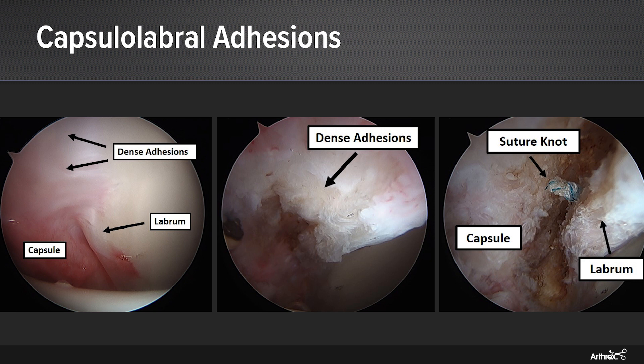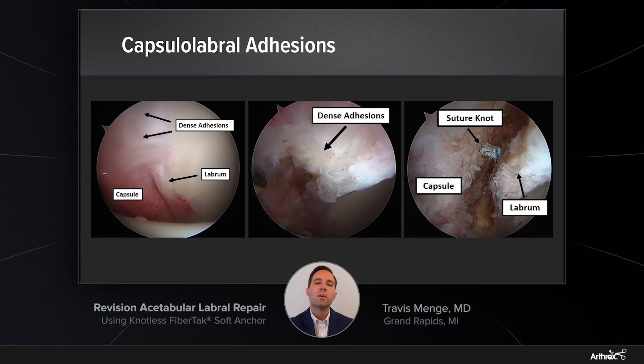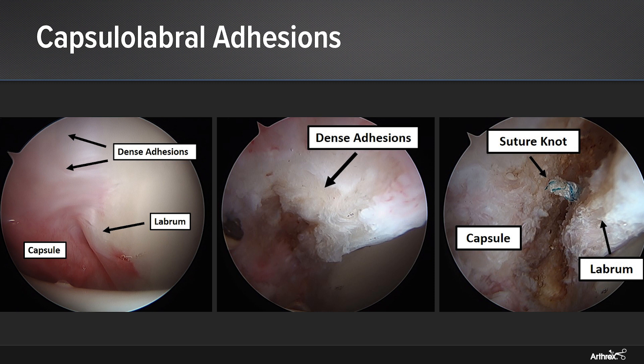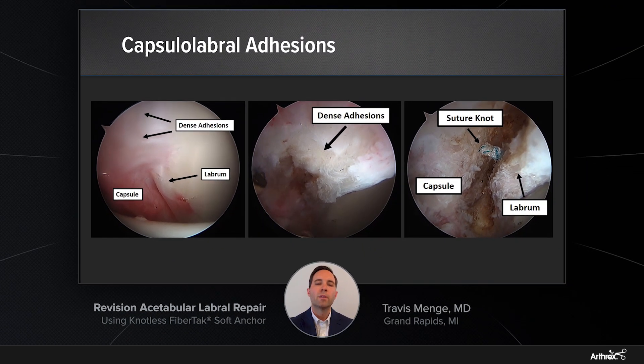You can see in the photos, beginning on the picture on the left, where in her left hip, viewing from an anterolateral portal looking anteriorly, you can see a wall of dense adhesions which had formed between the labrum and the capsule. This has resulted in eversion of the labrum and loss of the suction seal mechanism within the hip. As we carefully work using electrocautery to clear these adhesions and recreate the normal plane between the labrum and the capsule, you can see that immediately below the dense wall of scar tissue was a knot stack from one of her prior anchors.